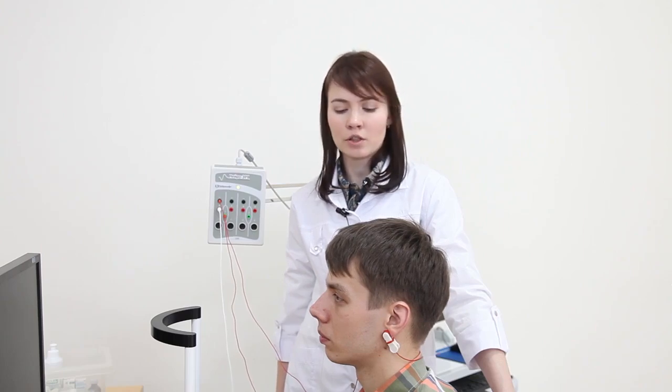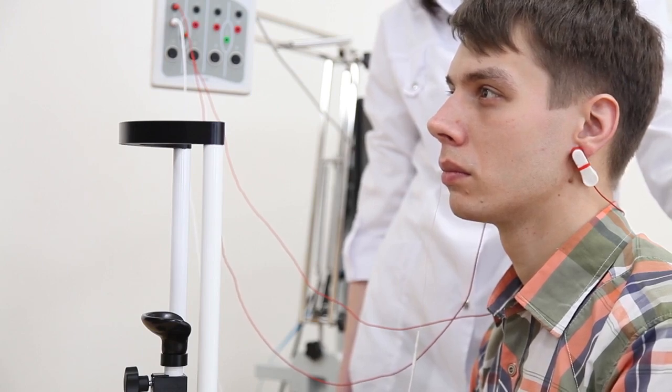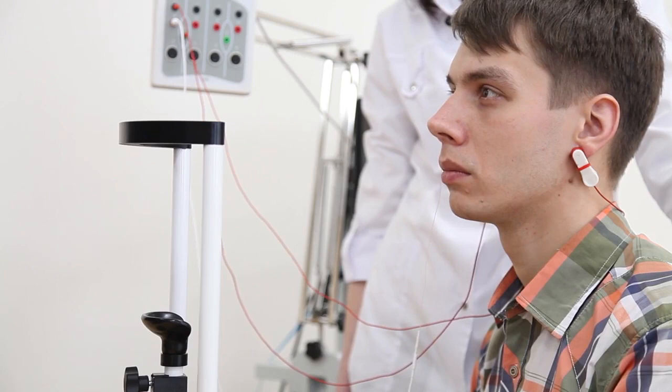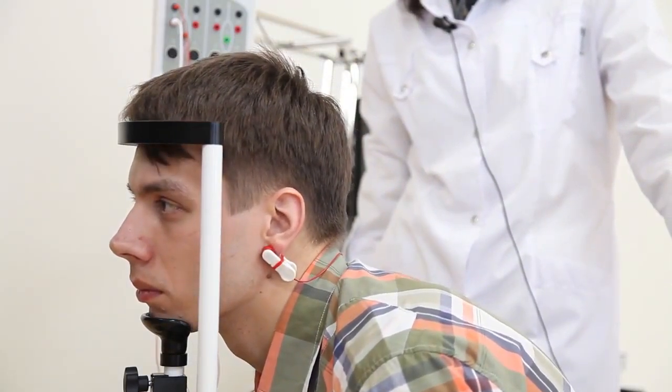To obtain reliable results, correct the vision acuity if it is not normal. According to the ISCEV standard, the successive monocular stimulation is recommended. That is why during the stimulation, the eye not being tested is covered with a black eye patch. Please position your chin on the chin and forehead support assembly.